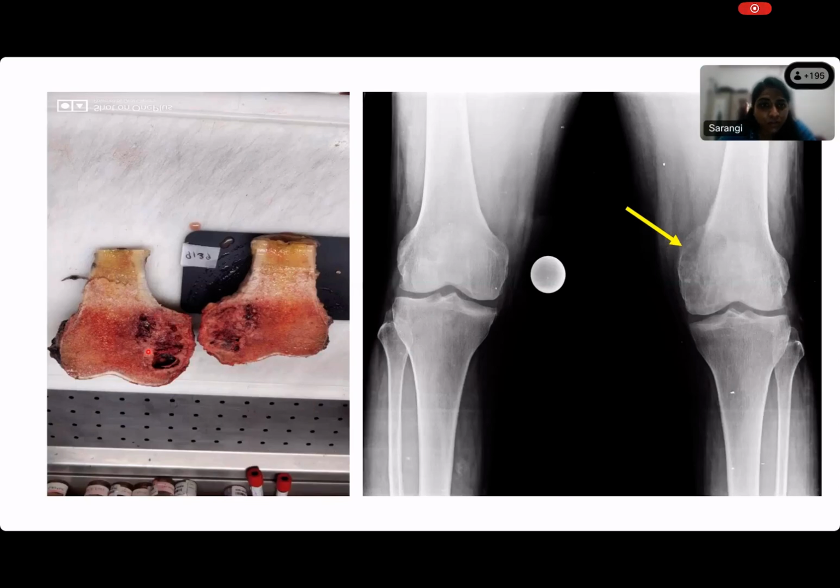All right, but what you're seeing is that it is sitting squarely within the epiphysis, no? Yes, ma'am. It's not at all in the diaphysis, although when the projection was made on the X-ray, which you can see here, we thought that it might have been metaphyseal, but it is not. This thing is sitting squarely in the epiphysis, and it has got many cystic spaces that are filled with blood. Yes, and you're right. It is on the medial side of this femur.